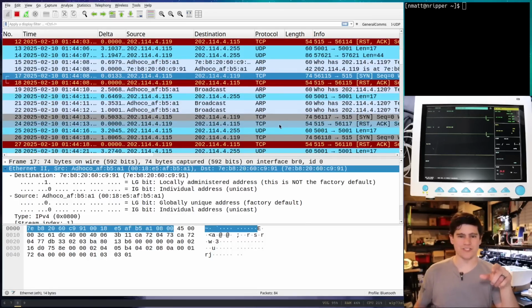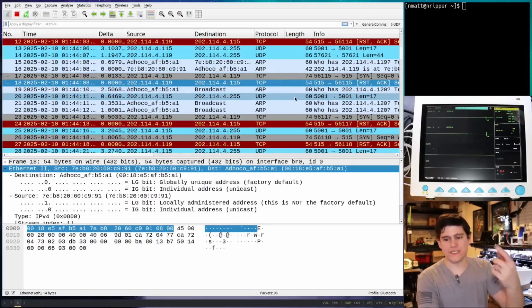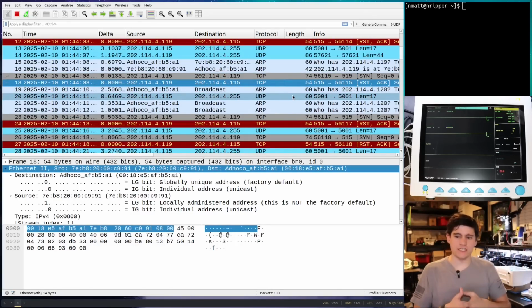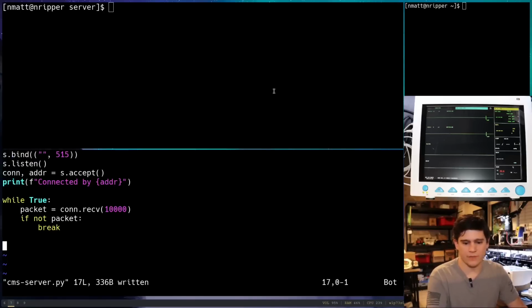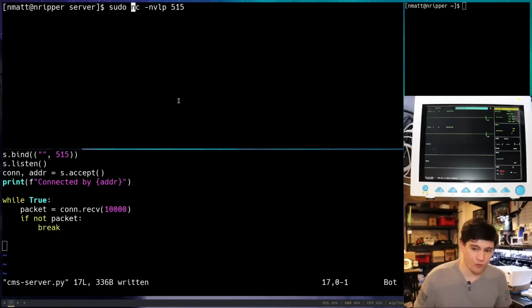But what we'll see in Wireshark when we sniff this data is that Wireshark will try to interpret the packets as this printer protocol, which really threw me off at first. I should have just looked at the raw data. We can see that a reset is getting sent back, and that's because nothing on our machine is listening on this port. So first, we're just going to set up netcat to listen on port 515. We're going to have to run that as root because any port below 1024 is a privileged port in Linux, and all that stuff.